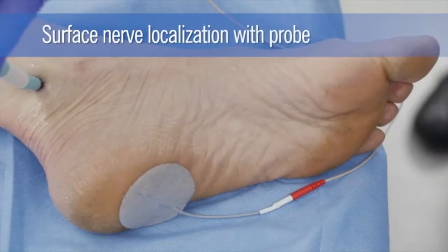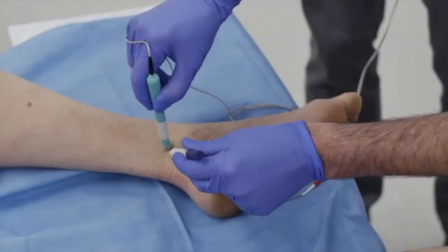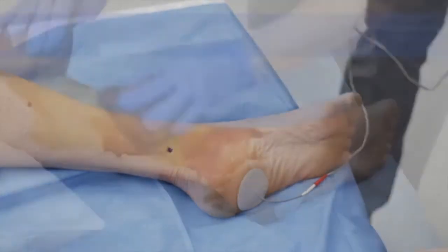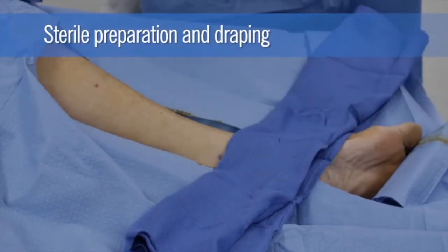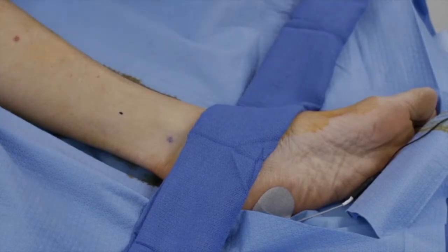Next, an external probe is used to elicit twitching of the flexor digitorum brevis muscle as seen here. The site on the skin that elicits a strong motor response with the probe is then marked. The lower leg is then prepped with betadine solution and draped in a sterile fashion. A second mark is then made 5 cm proximal to the neurosensory marking.